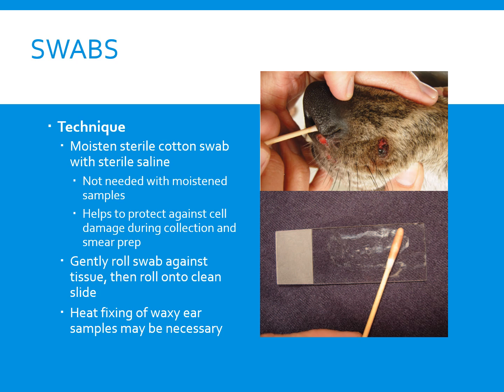If collecting a sample from a moist lesion, the saline is not necessary, or if the ear is moistened, it's not necessary to add the saline. After sample collection, the swab is gently rolled along a flat surface of a clean glass microscope slide.